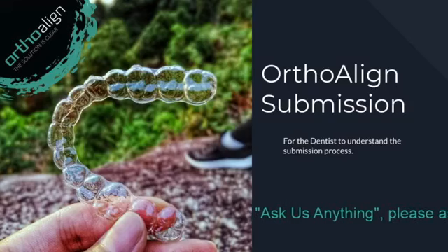Okay, so the next thing that we will move to is the x-ray data. What is the bare minimum for you to submit for us to do the orthodontic planning? The bare minimum is the OPG and the lateral ceph. We have a few customers that do send us a frontal ceph, but that is an addition. That's extra. It's not 100% compulsory. You don't have to make sure you send a frontal ceph. The OPG and the lateral ceph are more than sufficient for us to do our orthodontic treatment.